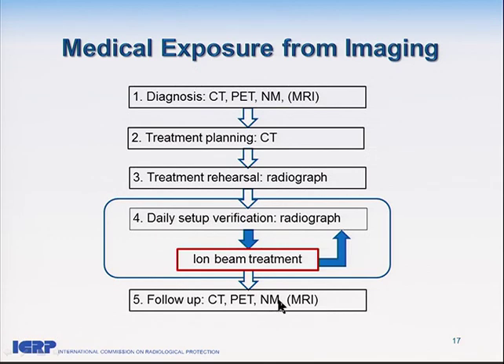Considering the effects on the treatment dose to the tumors, this is not so large, but it easily goes up to around 100 milligray. So it's not low dose. Well, compared with the treatment dose, it's completely low dose, so we don't have to care about that. But we also should think about this one.